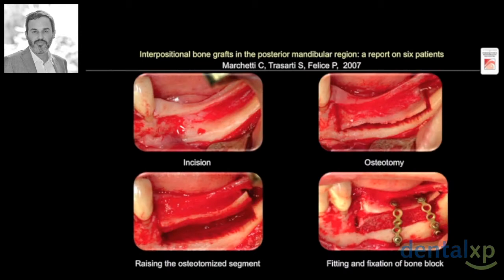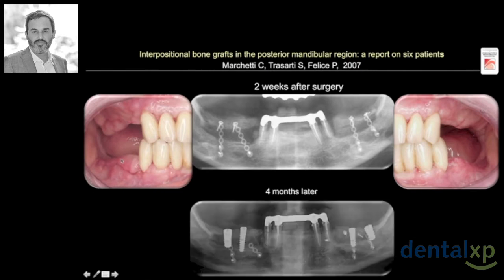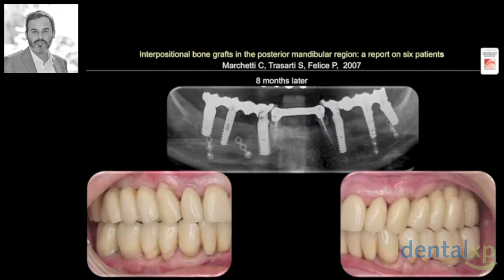We performed the inlay technique on 6 patients using a block of the iliac crest bone. After 2 weeks, the vertical increase is clinically evident. And then rehabilitation with definitive crown.